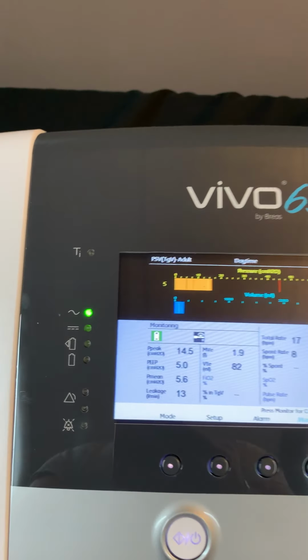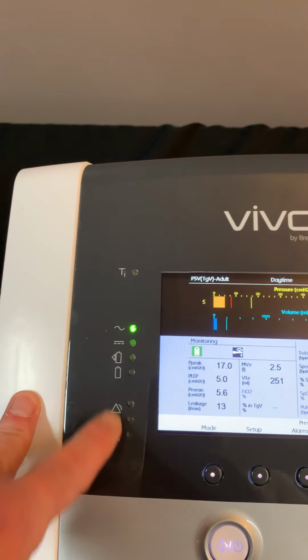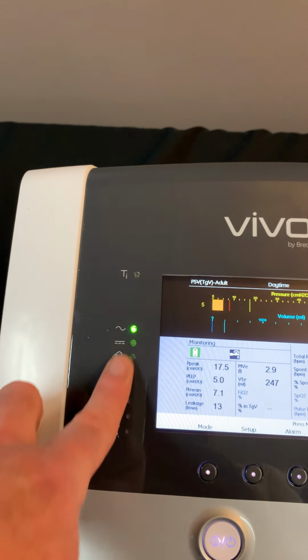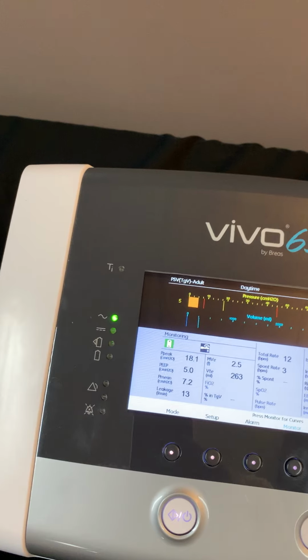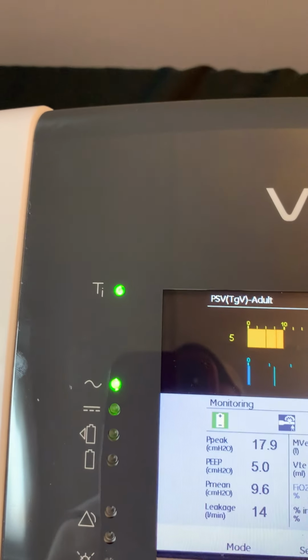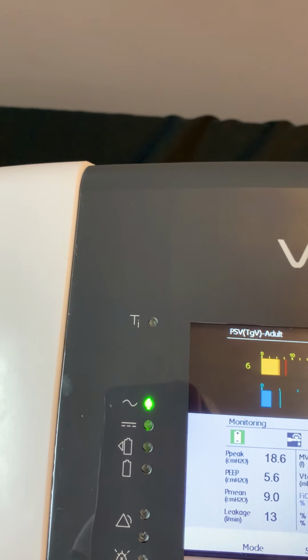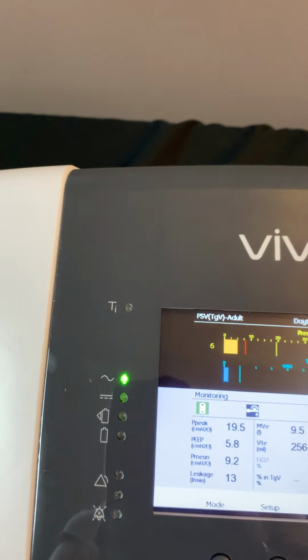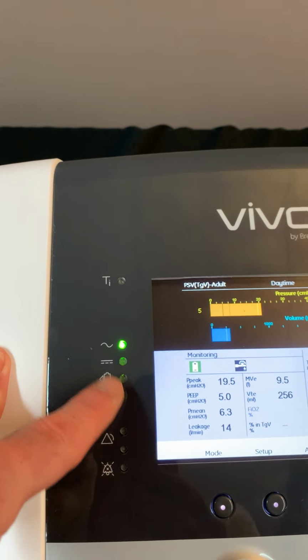So what are we looking at here? On the left-hand side of the monitoring screen, you'll see that there is a row of LED lights. We'll start at the top. That top LED light is labeled TI. When the ventilator recognizes a triggered breath from the patient, you'll see that TI light up for an inspiratory triggered breath.